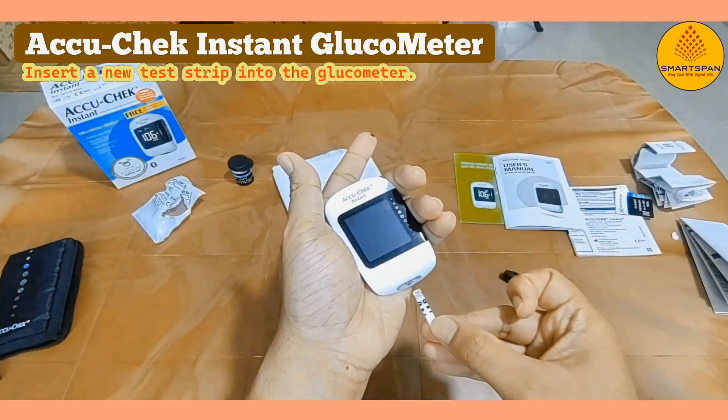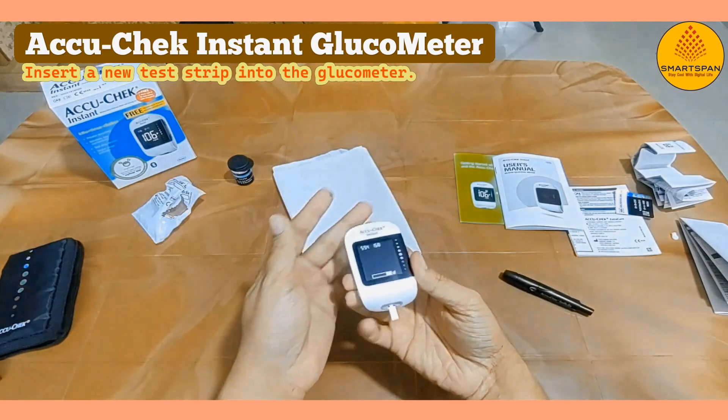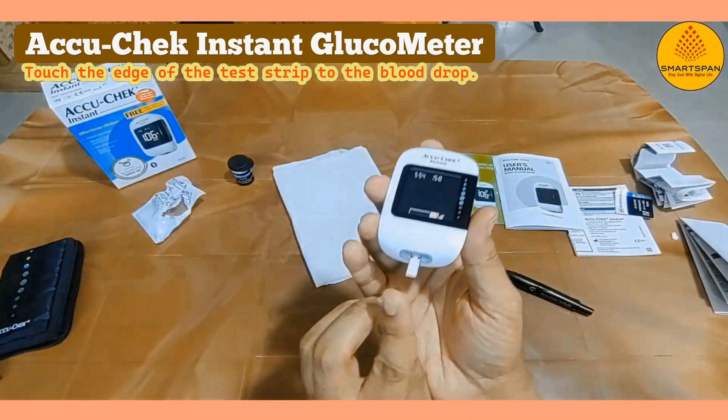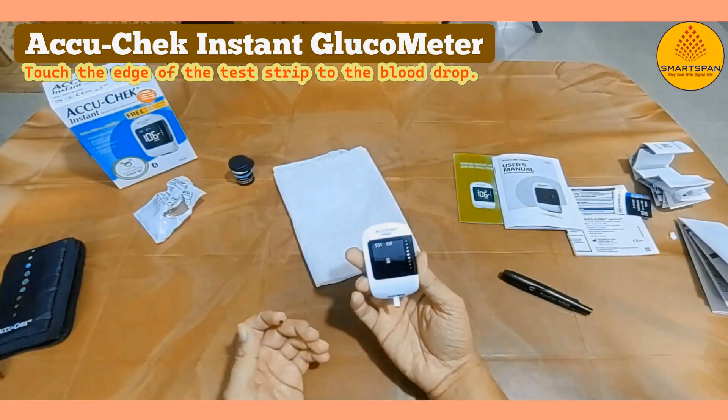Insert a new test strip into the glucometer. The device will automatically turn on once the strip is inserted correctly. Once you get the blood drop indicator, touch the edge of the test strip to the blood drop. The strip will draw in the blood for measurement.